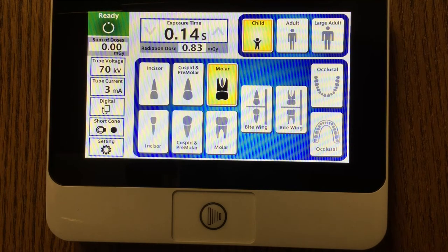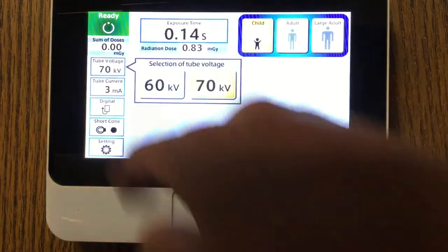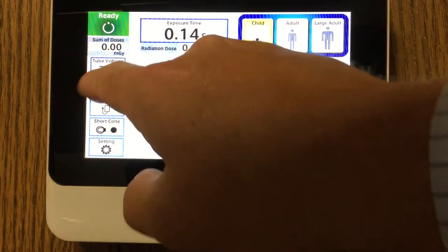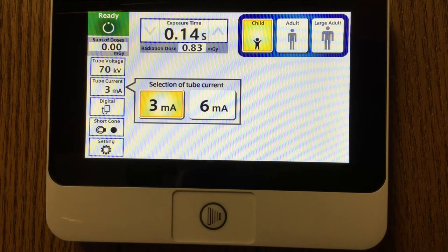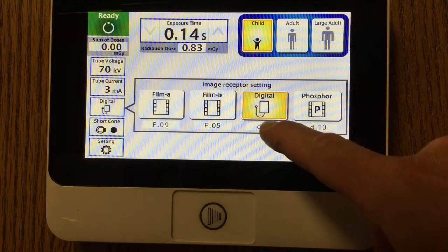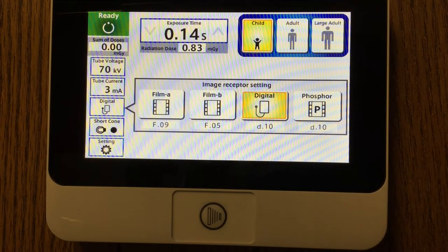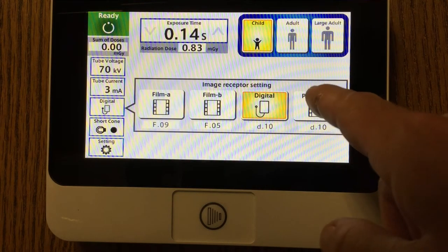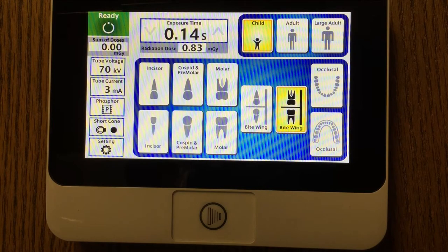As I made these changes, the exposure time as well as the patient dosage will change accordingly. The operator will also have the ability to program in whether they want 60 or 70 kV as well as 3 or 6 MA. Those selections will be made based upon if they're going to use a digital sensor, e-speed or d-speed film, or a phosphor plate receptor.